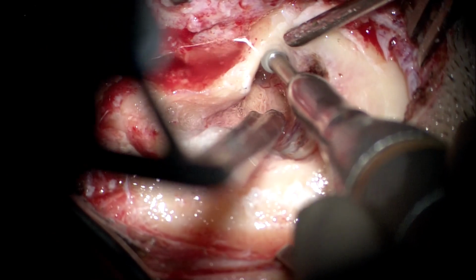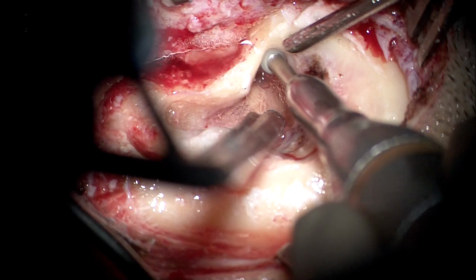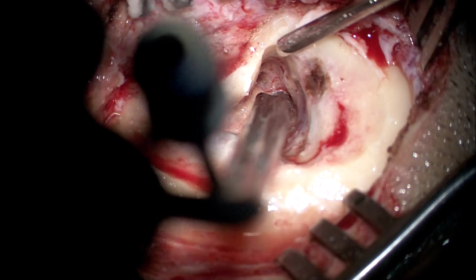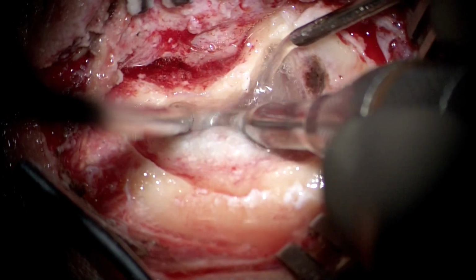Obviously, equal amount of bone must be drilled laterally as it is done medially, so that your drill and the suction get adequate amount of space to work inside without generating any conflict of instruments, as well as the water gets to drain, which is being used for constant irrigation.